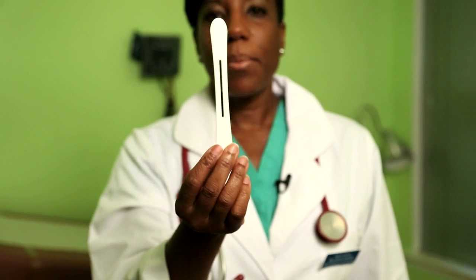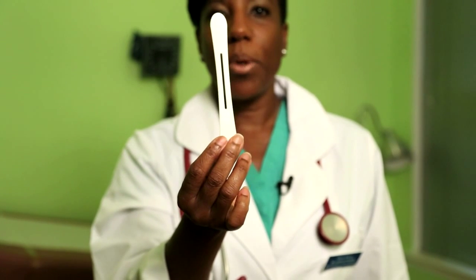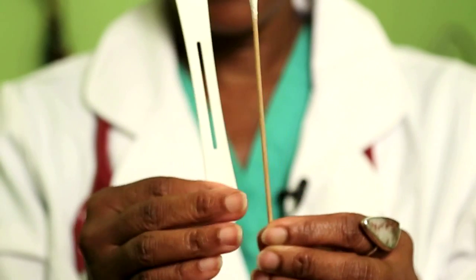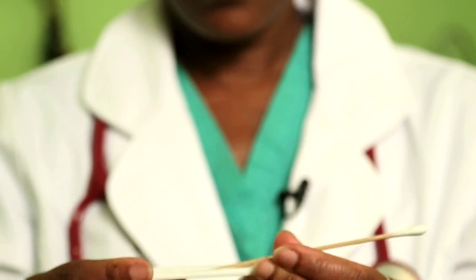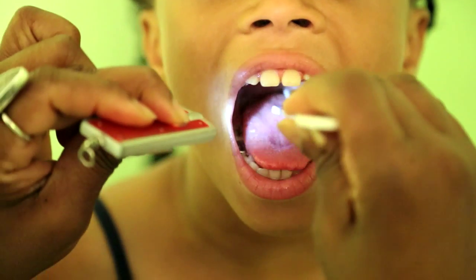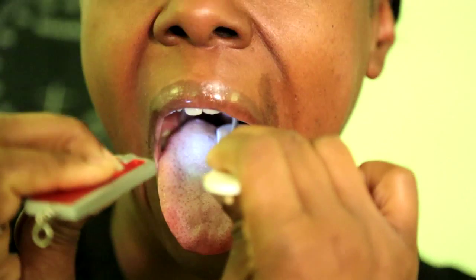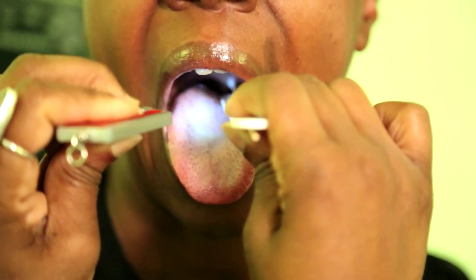This product is called SwabStix. The SwabStix is a tongue depressor that provides an opening for a Q-tip or a swab to be placed. This allows the practitioner to depress the tongue while at the same time visualizing the back of the throat, and also allows the practitioner to swab the back of the throat at the same time.